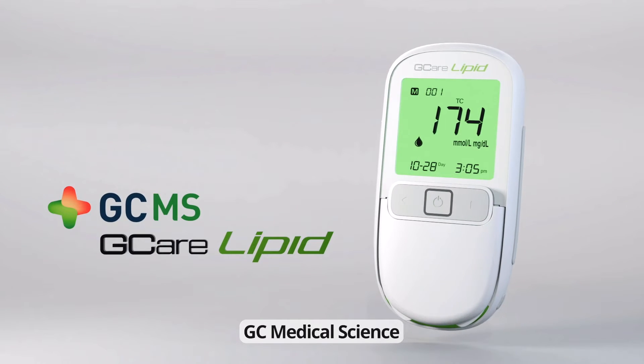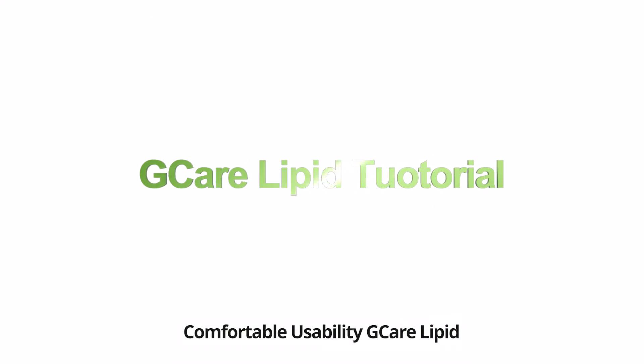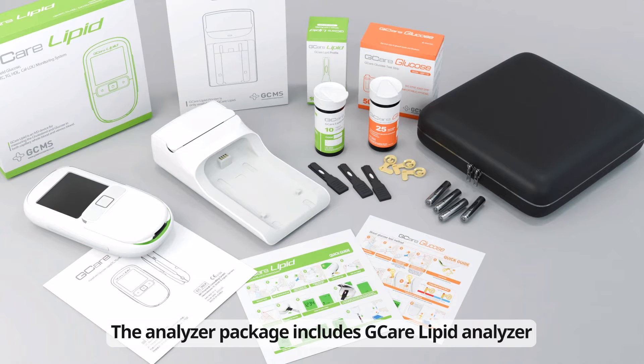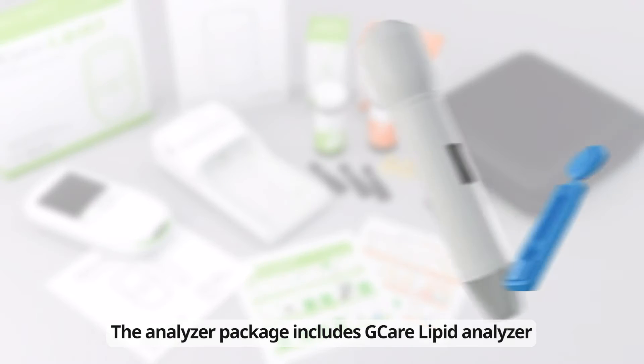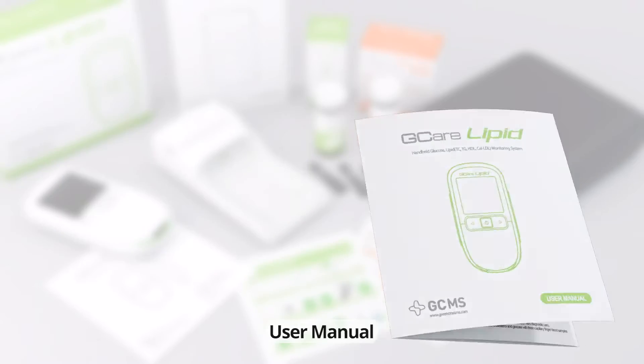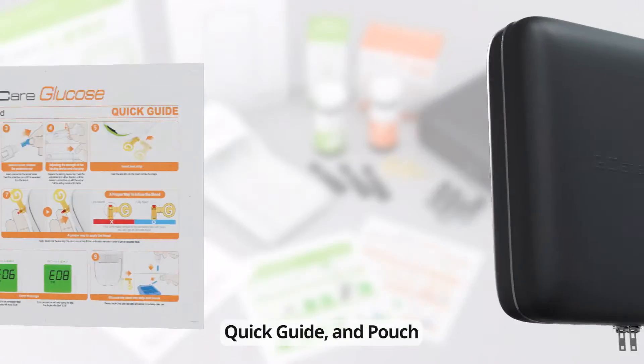GC Medical Science G-Care Lipid. Step 1: Product Composition. The Analyzer Package includes the G-Care Lipid Analyzer, Lancing Device and Lancet, four AAA batteries, user manual, quick guide, and pouch.